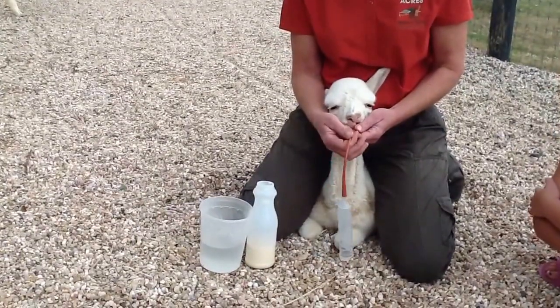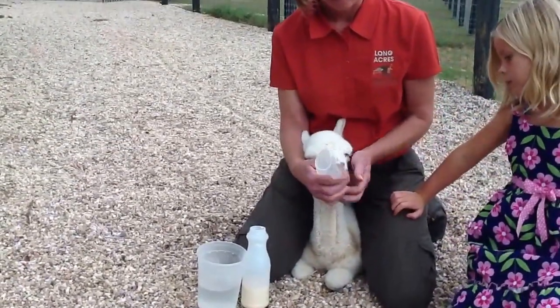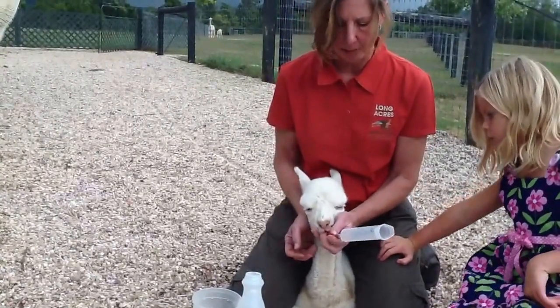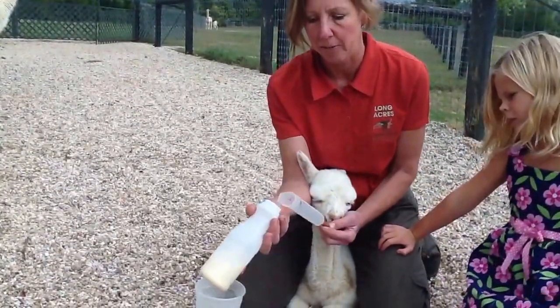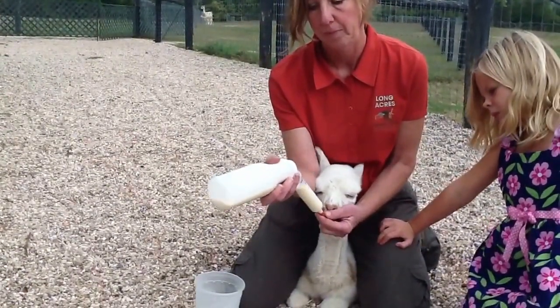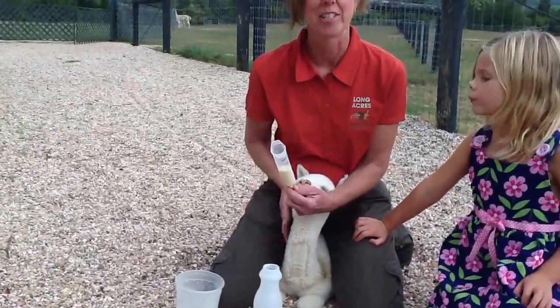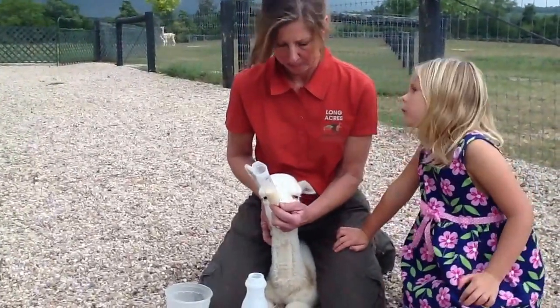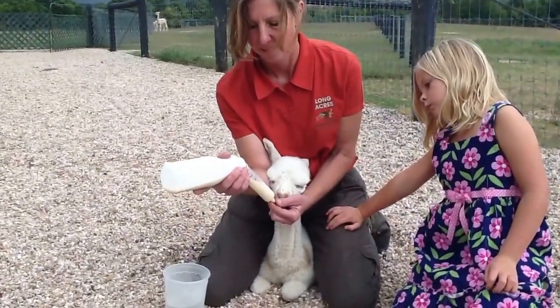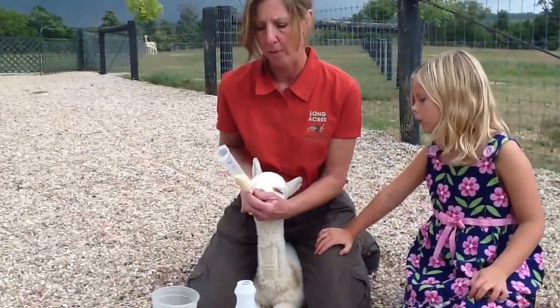Every once in a while, sometimes he'll cough. I have never actually hit when I go down in the trachea, but that doesn't mean it can't happen. One other trick I do is I get down to about this far, and I put my finger in so they kind of suckle on my finger. It stabilizes it, and then I just pour the milk in. And he's actually suckling right now — very happy. I really don't plunge it in ever; I just like gravity to take over and let it run in.